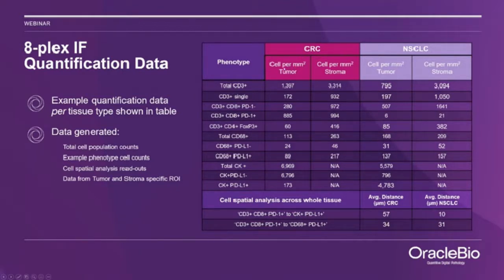And of course, this data is generated within each section, both within the tumor and stroma regions of interest across each section.